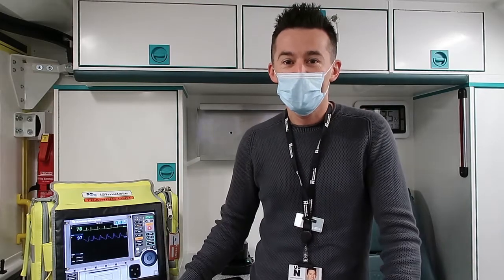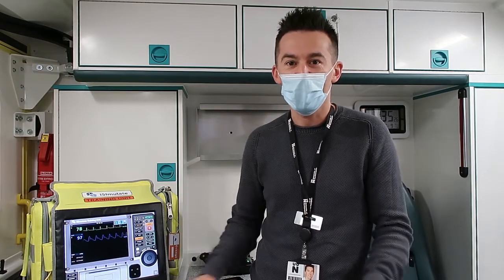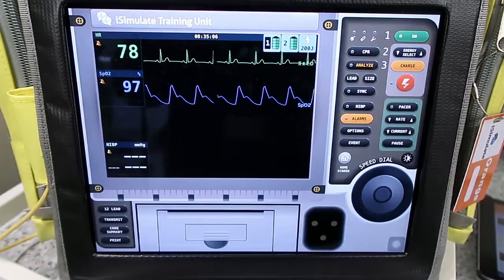Welcome to the Ambulance Suite at the University of Northampton. This is where we do most of our practical scenarios when we're training you to be a paramedic, and we've got lots of fancy equipment for you to explore. One of our main pieces of equipment we use is this.